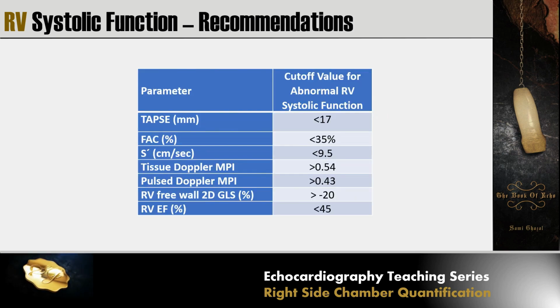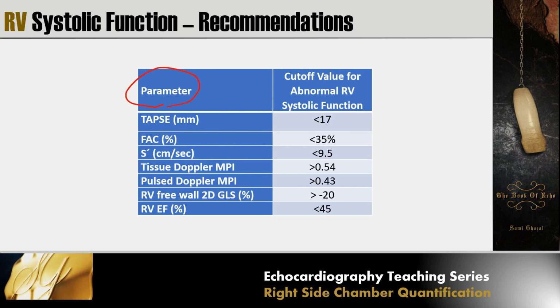In this table, we will see the RV systolic function parameters here and the abnormal value, or the cutoff value for abnormal systolic function here.